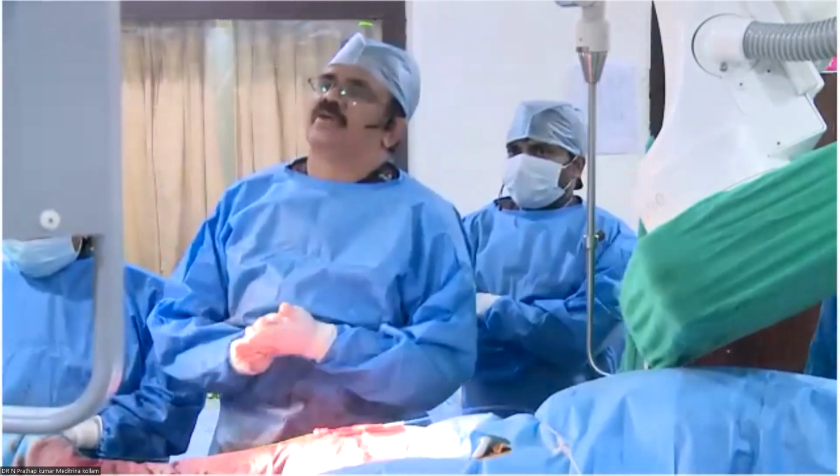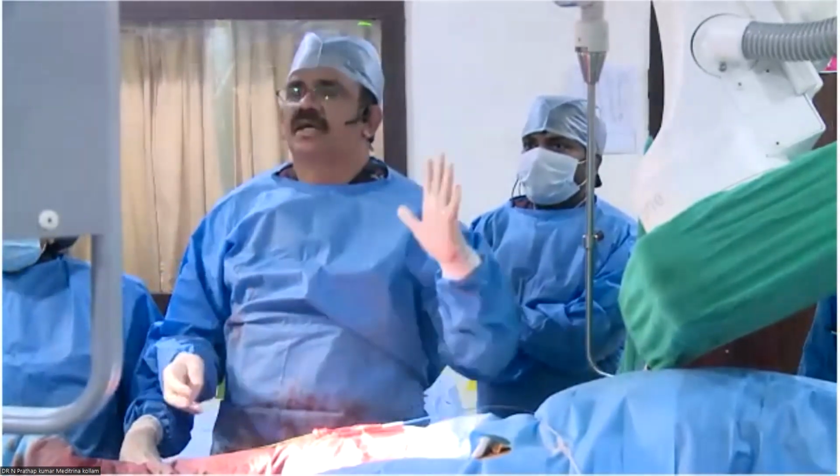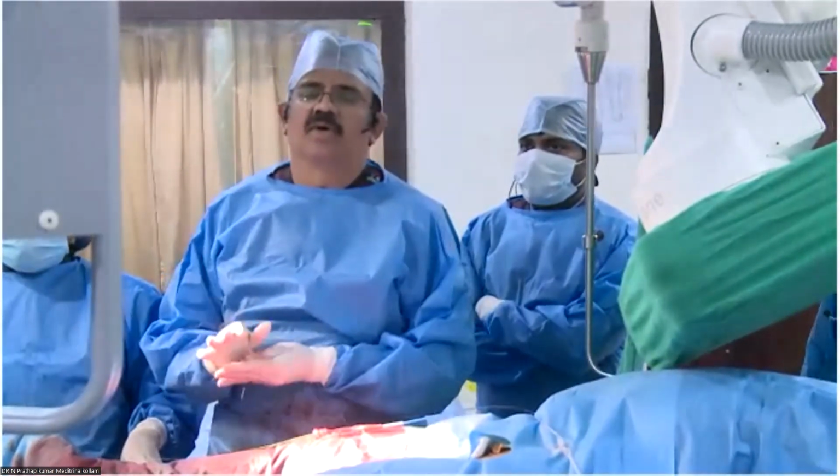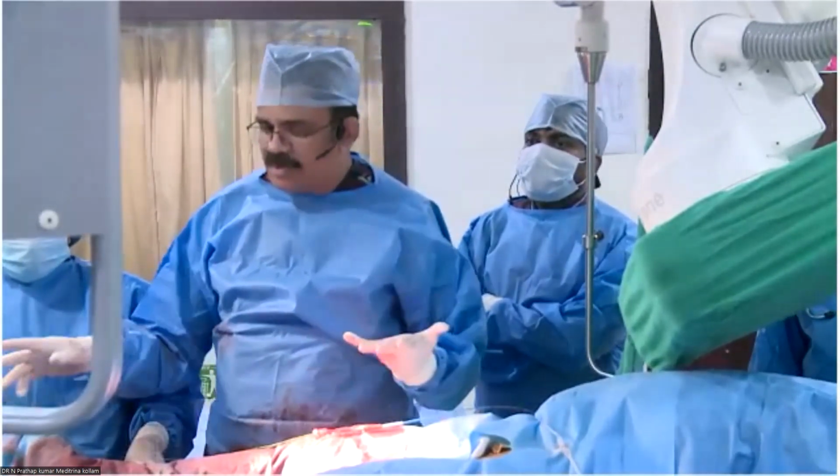My point is actually we could demonstrate a 3.5 stent in a 3 millimeter vessel in the demonstrated image. That is what yesterday Saurabh and I were fighting about with all the people. Nobody was believing that. Luckily, I could demonstrate that today.